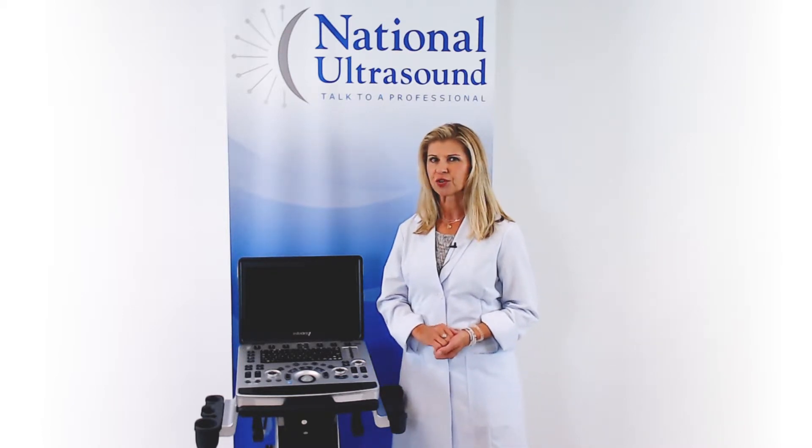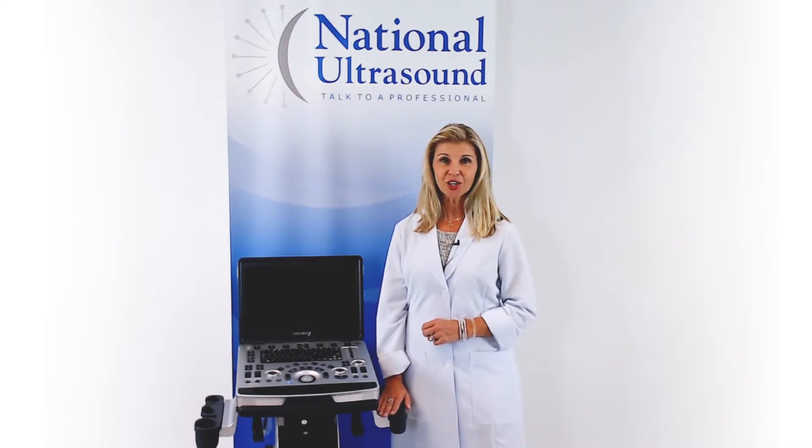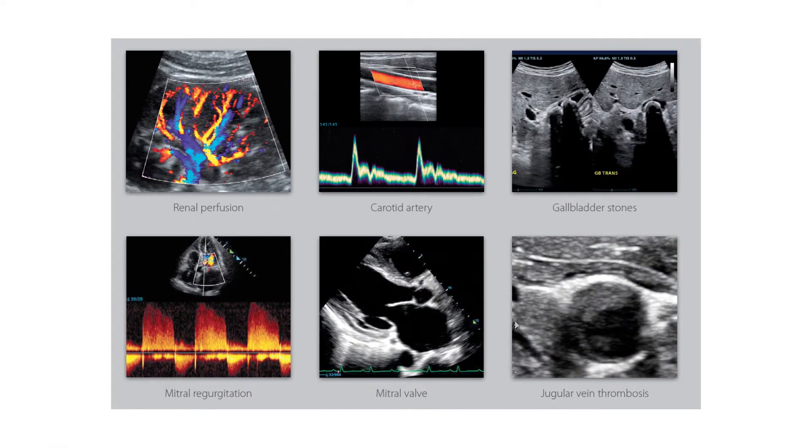Key features include the single crystal transducer for better penetration, 3D, 4D, contrast imaging, and 256GB solid-state hard drive. Highly focused features make this M8 Elite a perfect system for cardiovascular, women's imaging, and shared service applications.